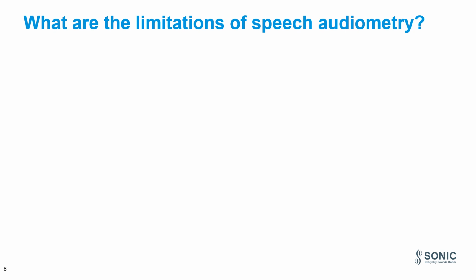We've talked about the benefits. Now, what are the limitations of speech audiometry? Time. Time is a big one because depending on the test, you can easily use up to 10 to 30 minutes just for doing speech tests, and that is quite long.